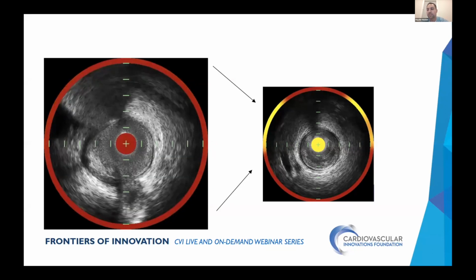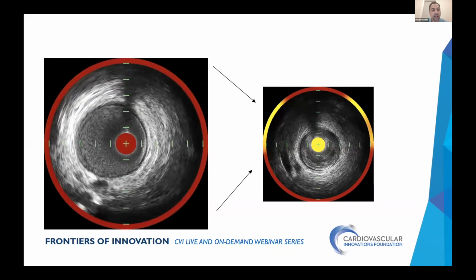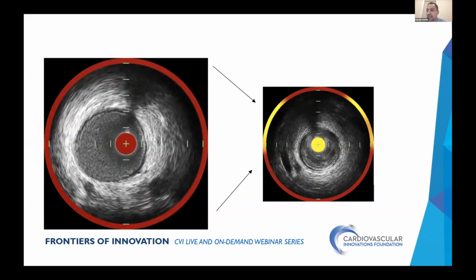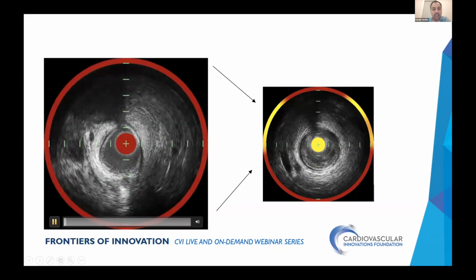It's a way for us in Prospect trial and LRP. That's what we used to define vulnerable plaque and plaque that has high risk of future events. So if you have an LCBI, lipid core burden index, over 4 millimeters of more than 400, that's the value that's associated with bad outcomes and futuristic events. And as you see here, the plaque was quite extensive in this patient.